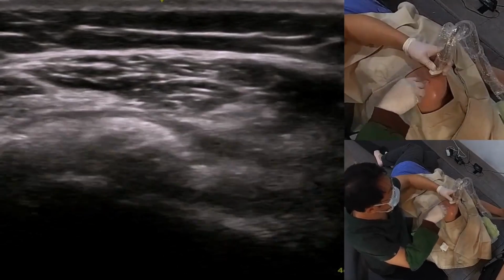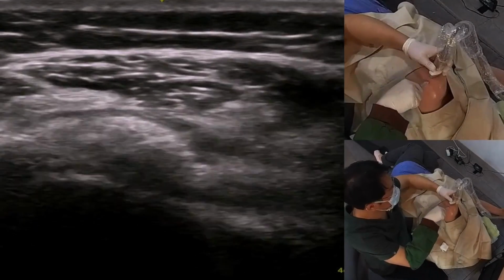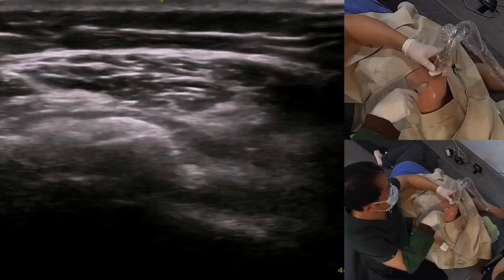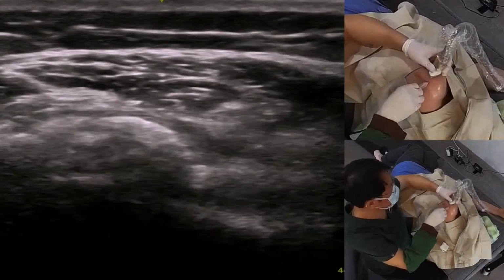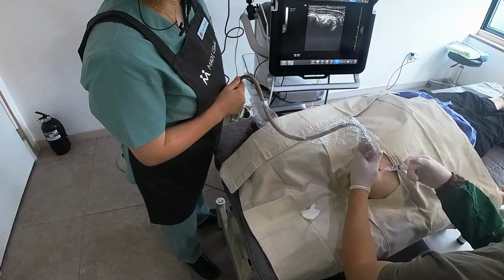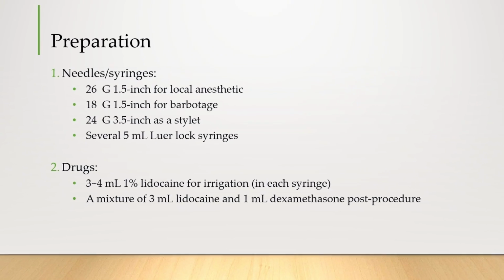The single needle barbotage procedure. Now, to the heart of today's discussion, the barbotage procedure. The barbotage technique is a minimally invasive, ultrasound-guided procedure that involves the fragmentation and aspiration of calcific deposits, providing pain relief for the patient.